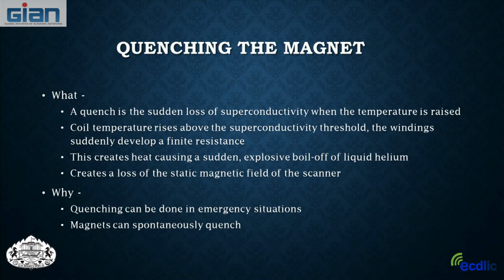And after they quenched this magnet, this liquid helium boiled off, and it was diverted into the parking lot of the hospital and went all over everybody's car. So it was a very big, sort of a sloppy way to deal with this. And everybody was up in arms saying, wow, we should have better regulations than this. So you really have to be careful. You have to consider who's going to be around this magnet. Make sure you have posted signs. Make sure that people are aware, and make sure that when you quench these magnets that it goes into a place where there's not going to be people standing around.